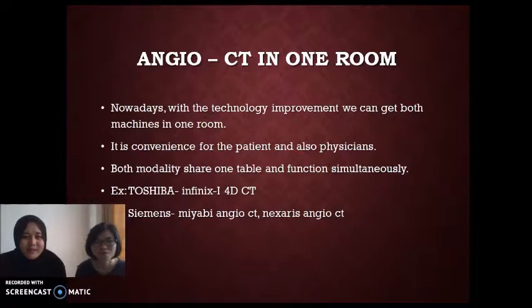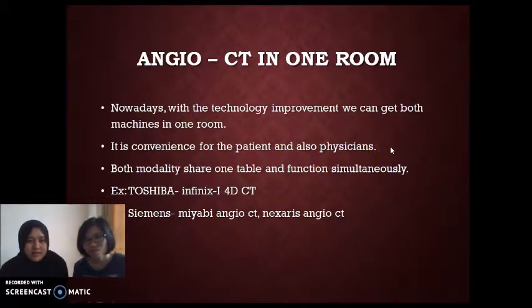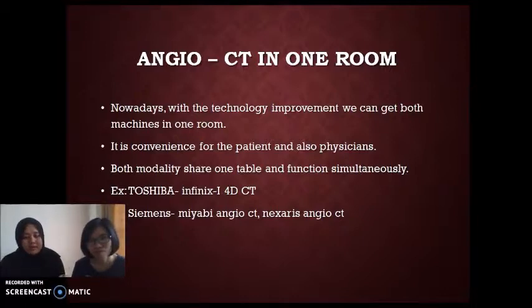It's very convenient for the patient and also the physician. It's easier for the patient because we do not need to transfer the patient from CT scan to angio. With this hybrid, we can do the diagnosis using CT scan and simultaneously do the treatment if there is any pathology. So it's easier for the patient and also for the physician or doctor, and it saves time for the procedure. The patient does not have to make another appointment for the treatment, and the procedure of the treatment can be done simultaneously.